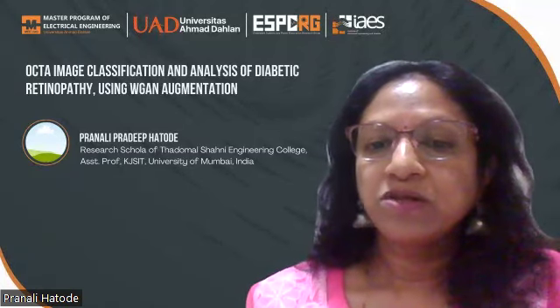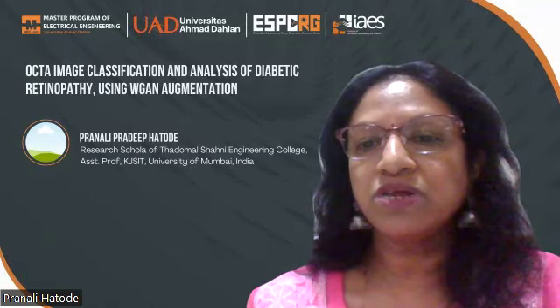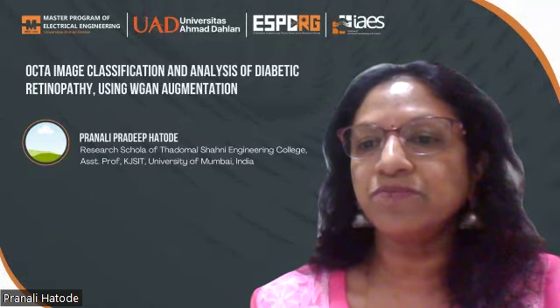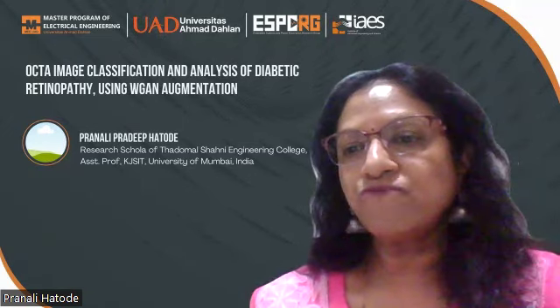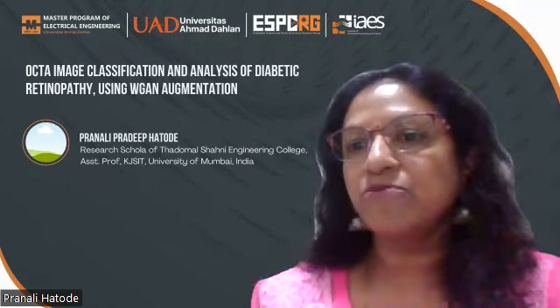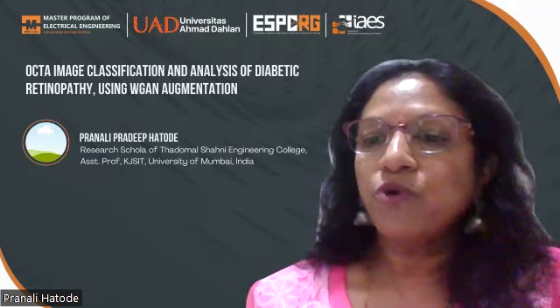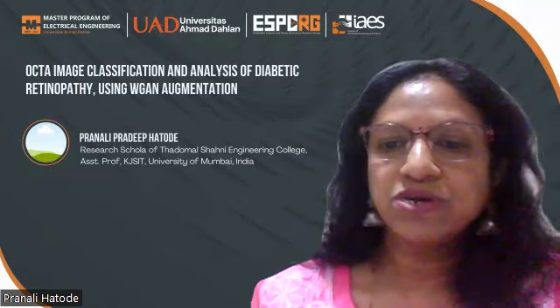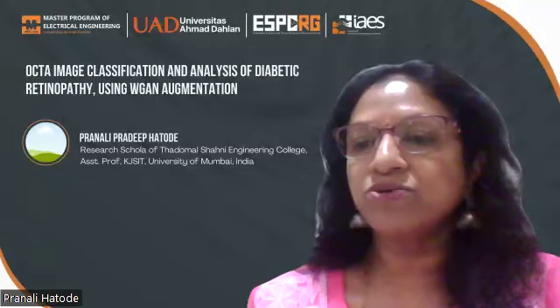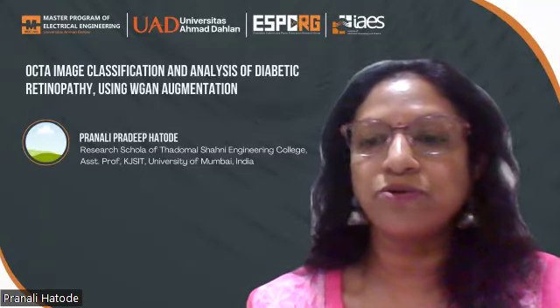Later, with the same model, I used more images, that is 47,500 images generated by GAN, and it improved the result to 37.57%. Later, I went for WGAN augmentation. I generated 47,500 images. On 150 epochs, I got 40.30% accuracy.